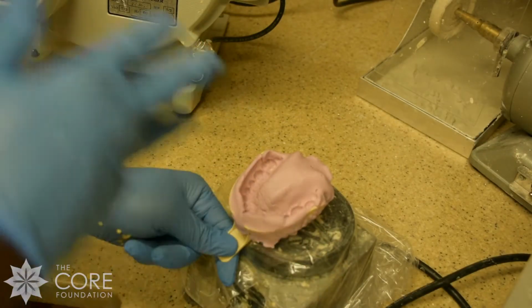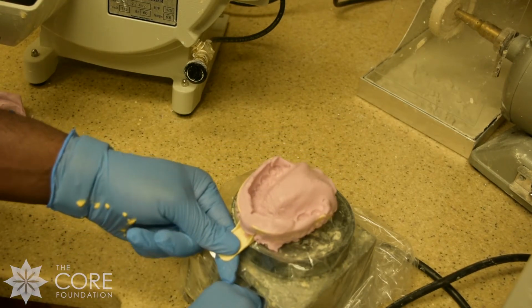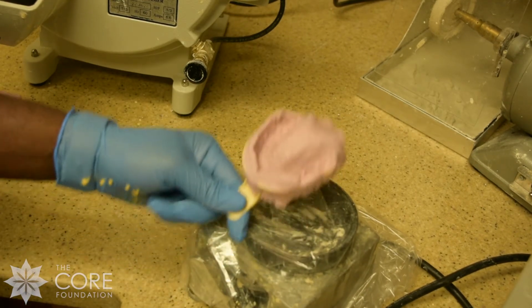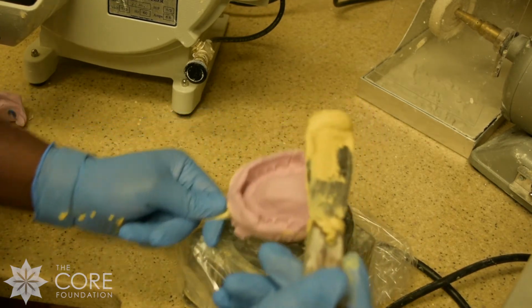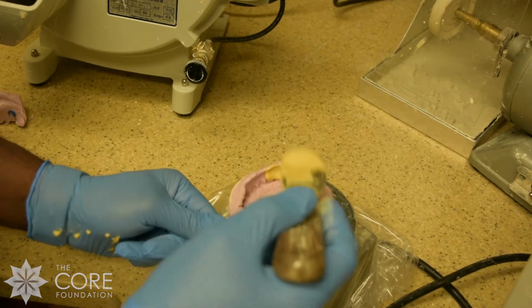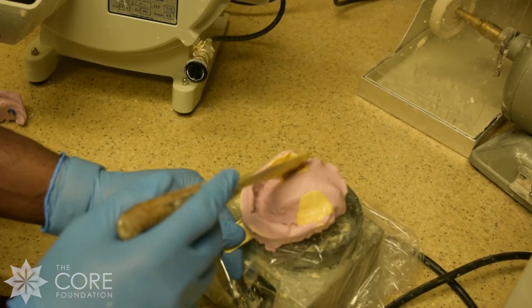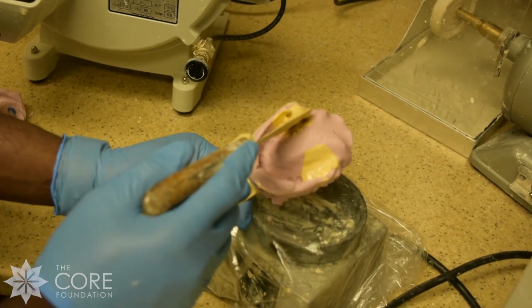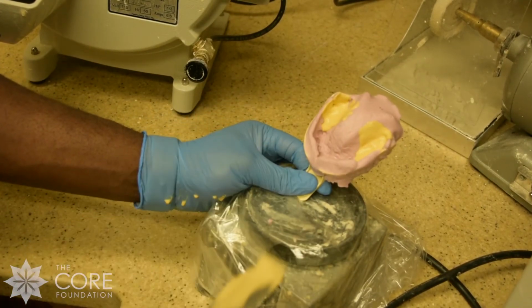All right, so we've mixed our stone and now we're going to pour it up. What we do is turn on the shaker. And then as we're filling this, we'll slowly start from one end to the other. And we'll slowly watch this slowly go over all the places.